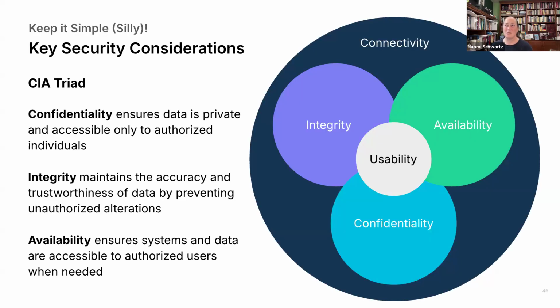So, all right, what does it actually mean? Let's keep it simple. Starting fundamentally at the CIA triad, we've got confidentiality. That means that my data is only shared with authorized individuals. Integrity. My data that was transmitted by object A is received by object B, and it is not changed, intentionally or unintentionally. Availability. If there's a problem with this system, I can still operate through.